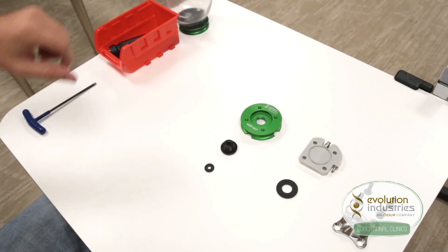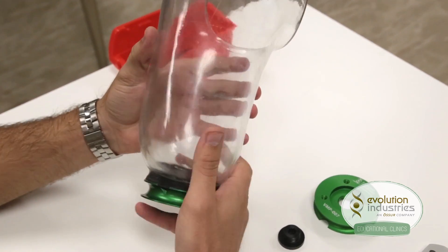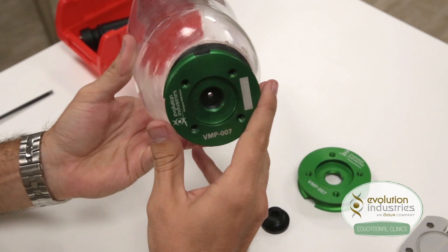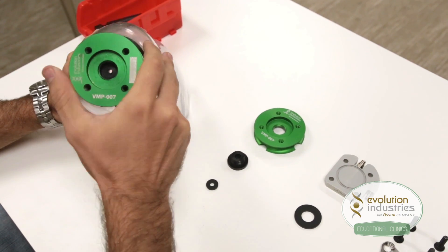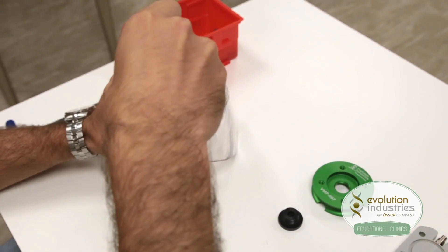To set up your Unity system, take the socket with the valve plate gunked in place. For more information on setting up the valve plate, check out the valve manual on our website. Once the valve plate is gunked onto the socket, the rest is pretty simple. First, take your small seal and insert it into the center of the mounting plate.